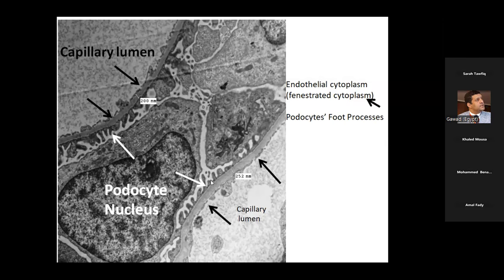On the other side, these are the podocytes. The podocyte nucleus, that's the nucleus. And these are the podocyte foot processes. We all hear about the podocyte foot processes.